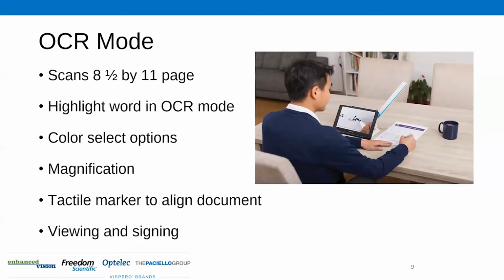You'd be surprised how easy, for example, touchscreen, this is a touchscreen device. There aren't any controls other than a power button on this device. So we have to take enormous care when we're producing the user experience and user interface to ensure that we're not creating an additional barrier that's going to make it somewhat difficult for someone to go from, for example, a distance mode to a reading mode.